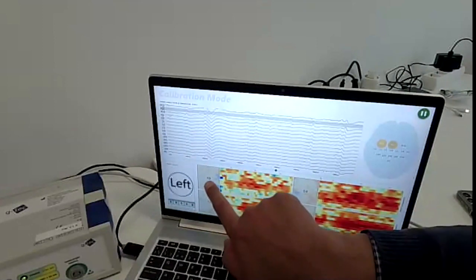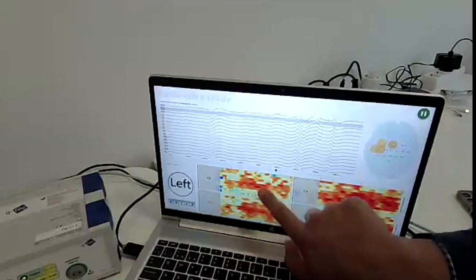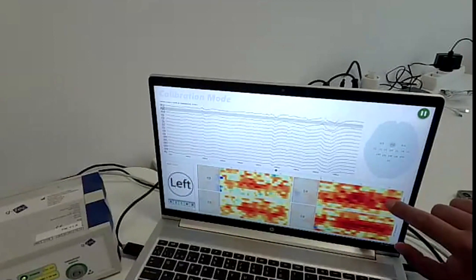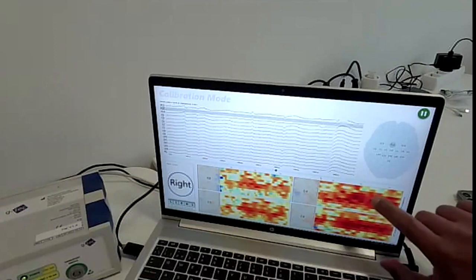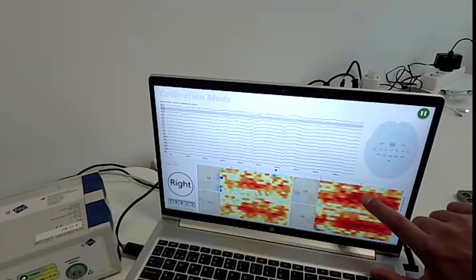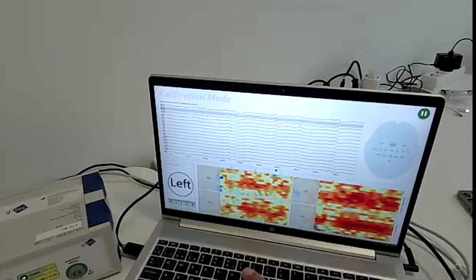If we know that the C3 is placed over the left hemisphere, we expect that the C3 shows more blue color, and in the C4 electrode, which is in the right hemisphere, during the right imagination we expect that this cortex is not activated, that this cortex is kind of silent. In this silent period, in this deactivation period, the ERD shows more hot colors like red or reddish, orange, right? So this is how the ERD-RS plots should be read, but in a very simple way. They are more difficult, but just to give you an idea, right?